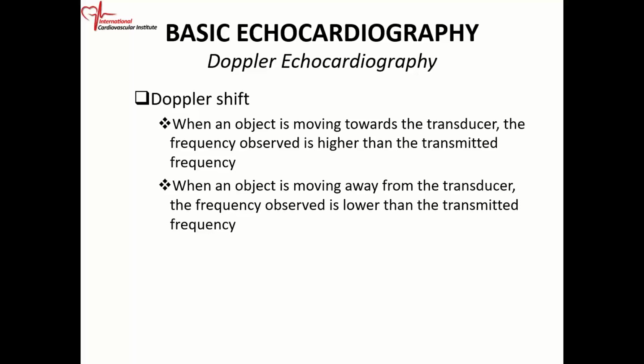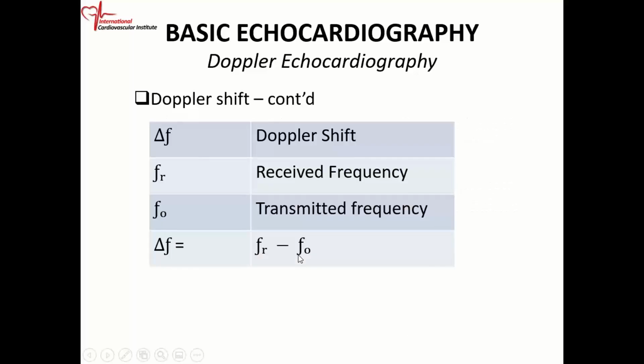And similarly, when an object is moving away from the transducer, the frequency observed is lower than the transmitted frequency. So that is the Doppler principle.